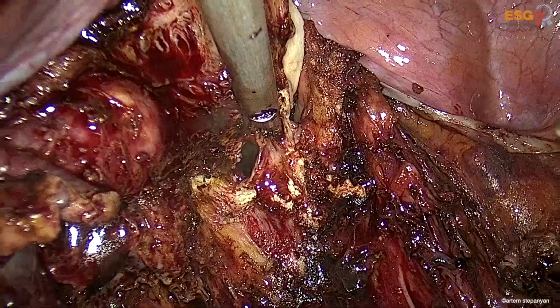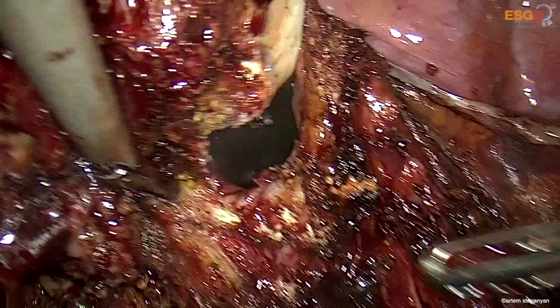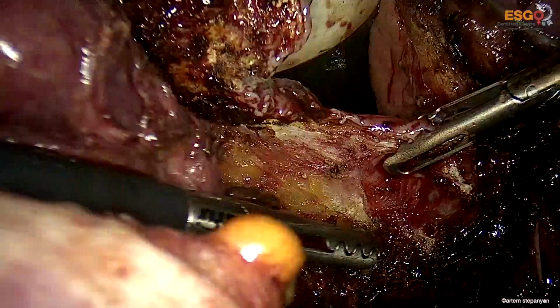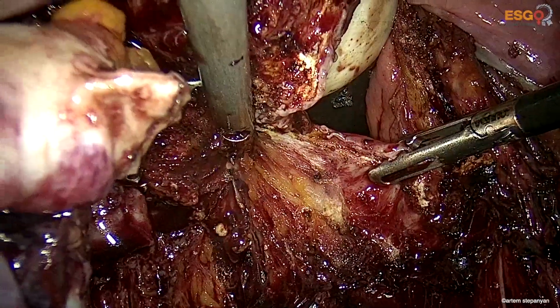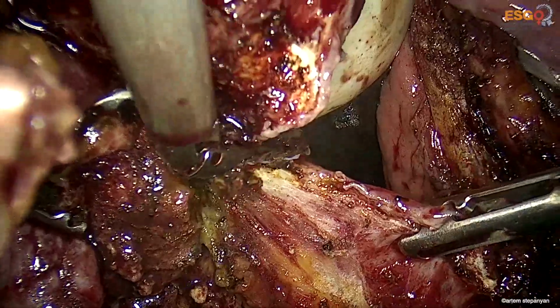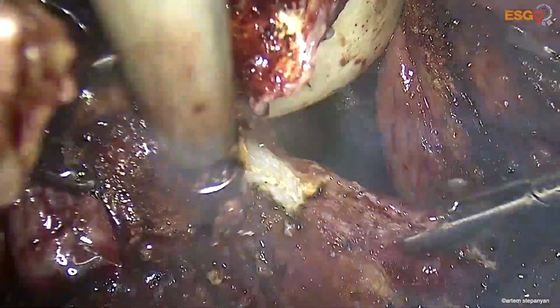Now we move to the right side. We cut the posterior fornix of the vagina. And here we see the vagina lumen is open. We have a good visual control over the rectum. And here we dissect the leftovers of mesorectum, detaching it from the posterior fornix, and carry out our incision towards the previous incision on the left side.